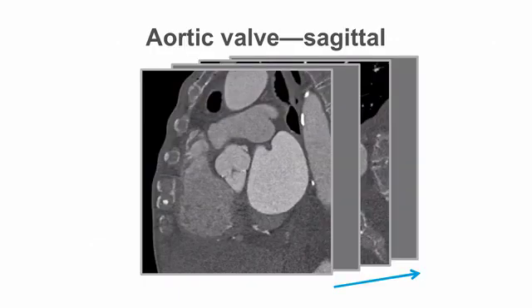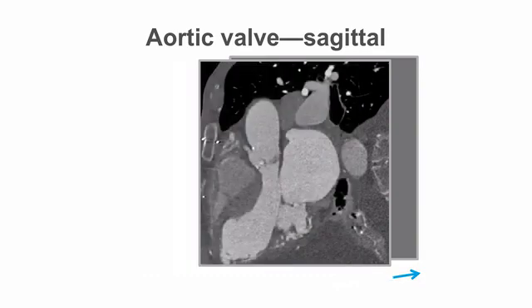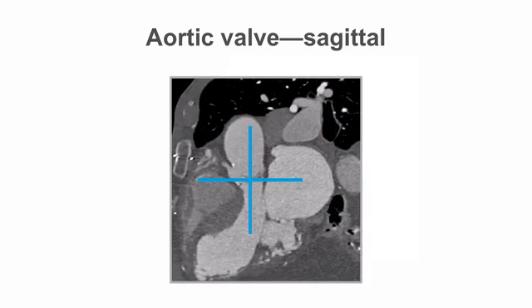The effect that this rotation has had on the sagittal view of the aortic valve is that it opens up the aortic valve with the ascending aorta. Once we have aligned the crosshairs with the aortic valve first in the coronal view, this is then done for the sagittal view over the aortic valve.